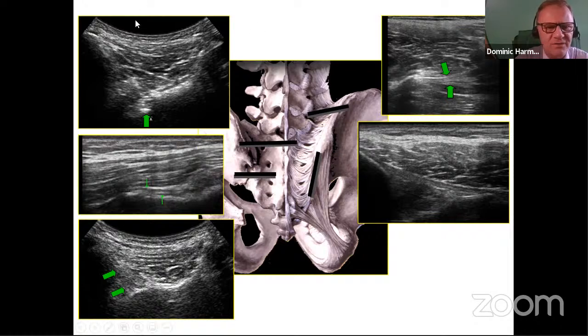Now, if we go up to this one here at the top, this represents this line across here. This is the sacrum, this is the ilium, okay? And you'd have to come down further before you're getting towards the sacroiliac joints. This is the sacroiliac joint here, okay? There's loads of connective tissue and attachments, muscles going on here around the medial aspect of the sacroiliac joint. On this side, high up, you have a thing called the iliolumbar ligament. So it's from L5 up to the ilium, okay?